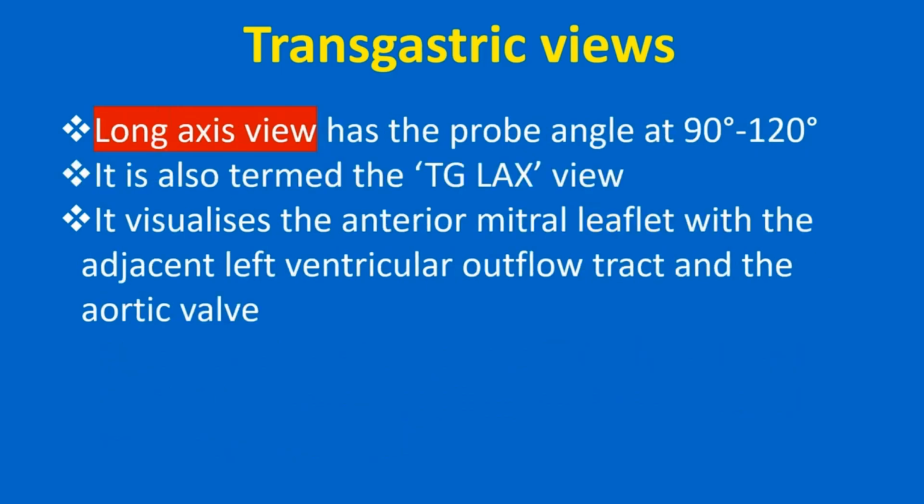Long axis view has the probe angle at 90 to 120 degrees. It is also termed the TG-LAX view. It visualizes the anterior mitral leaflet with adjacent left ventricular outflow tract and aortic valve.